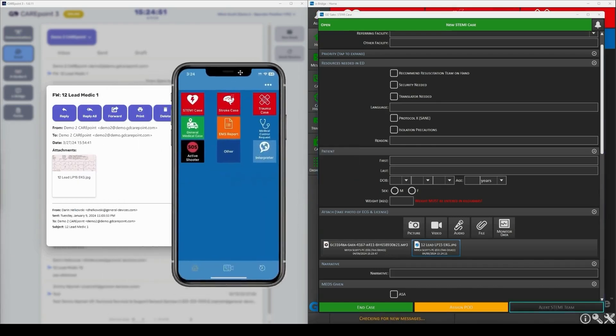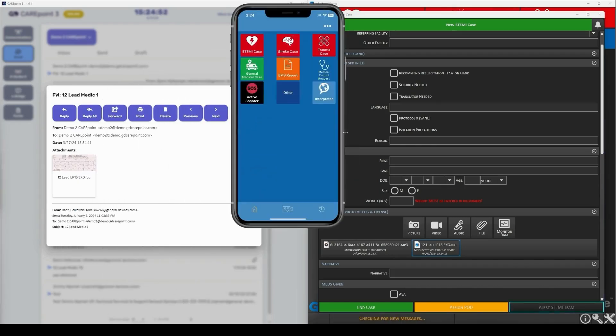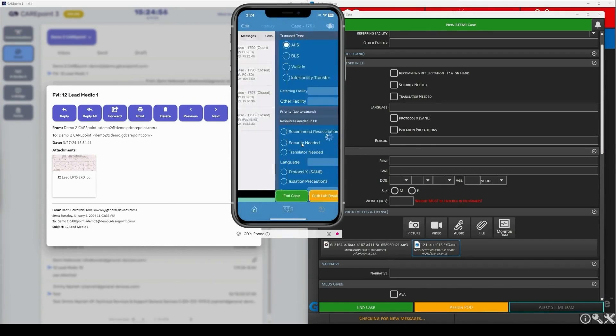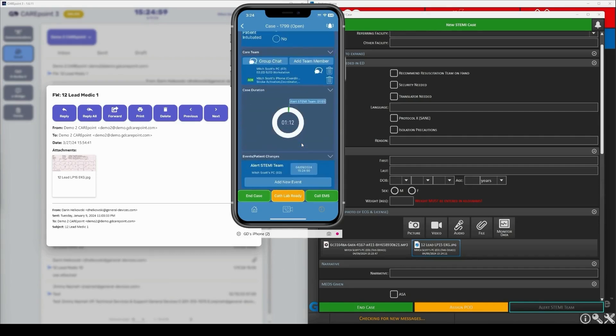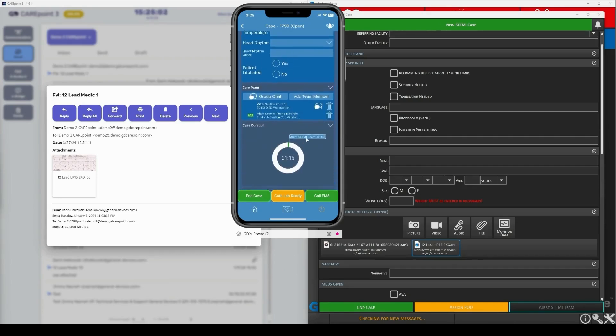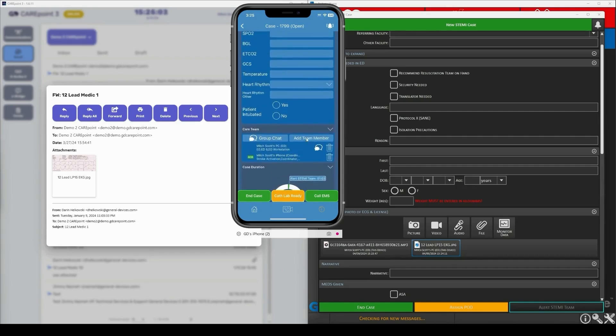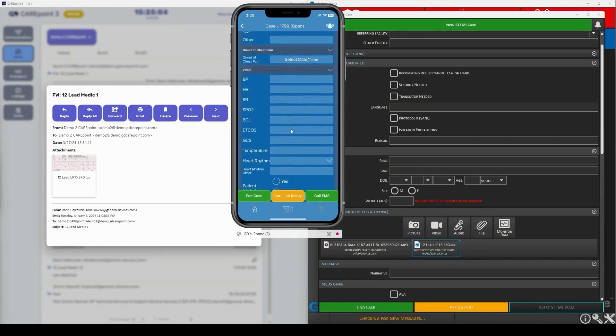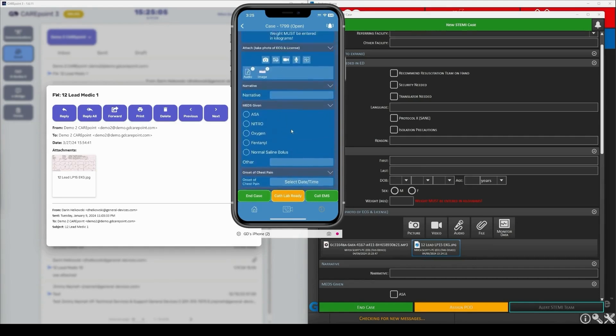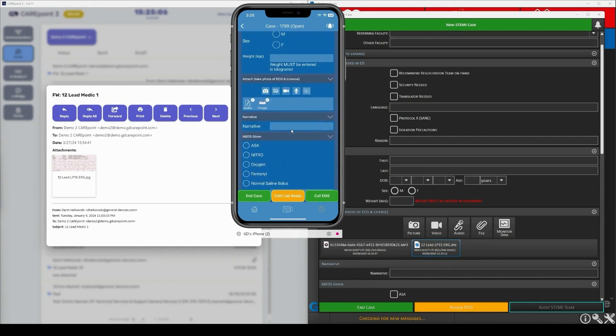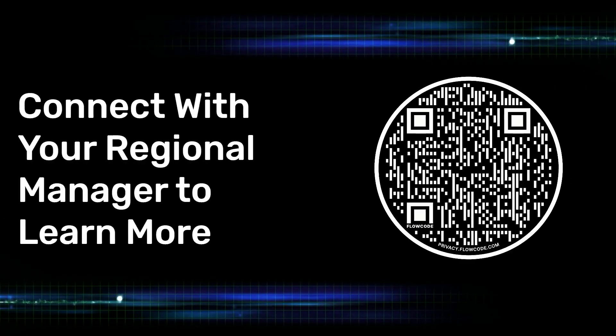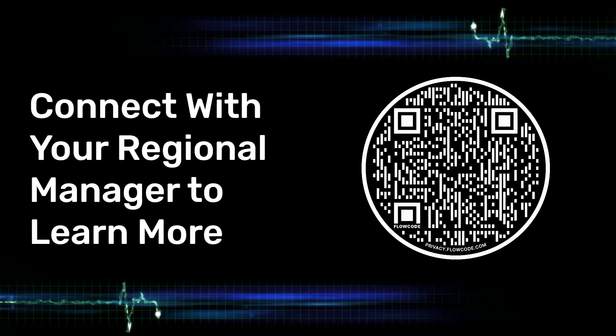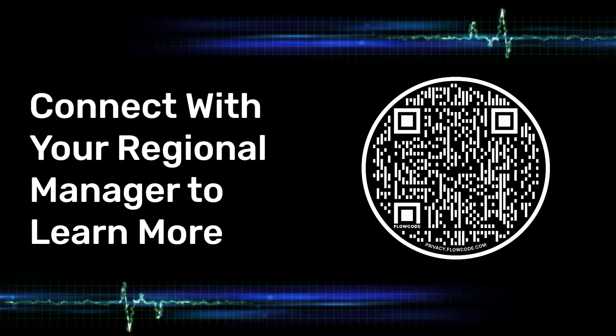On the STEMI team's phone, eBridge gets an audio and visual alert. The team is able to view all captured data and the case clock, listen to the call, and access the 12 lead EKG to prepare for the incoming STEMI patient.